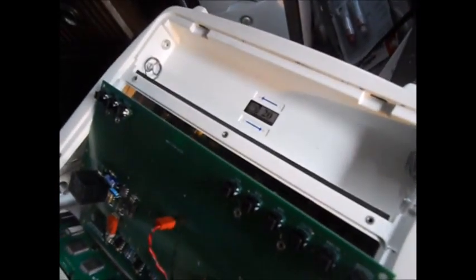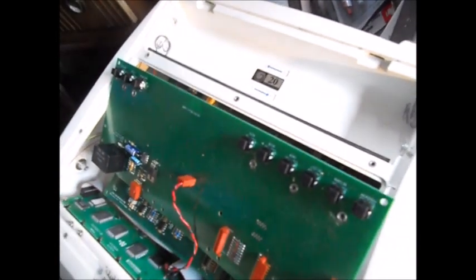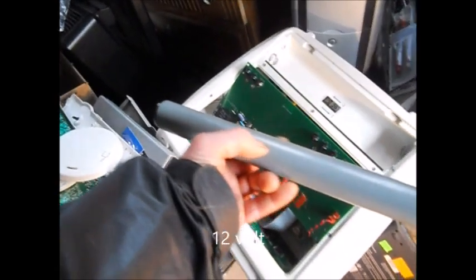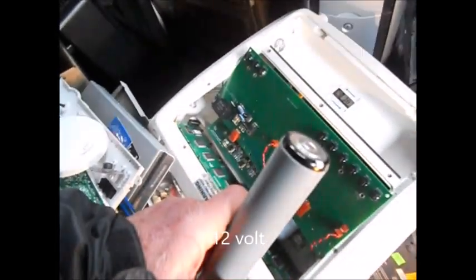Looks like they've got 8 D cell batteries. They come in these little packets, whatever they are, holders. And so that's what we need to do to check this.